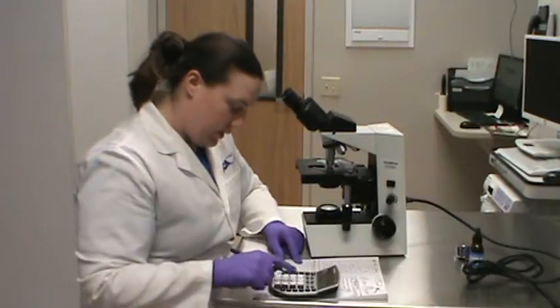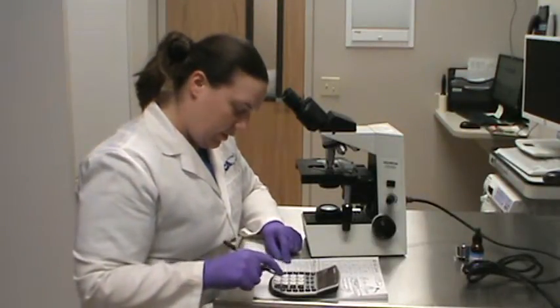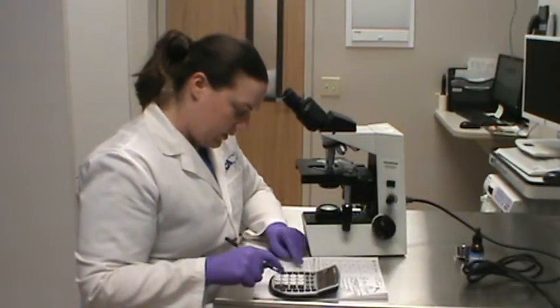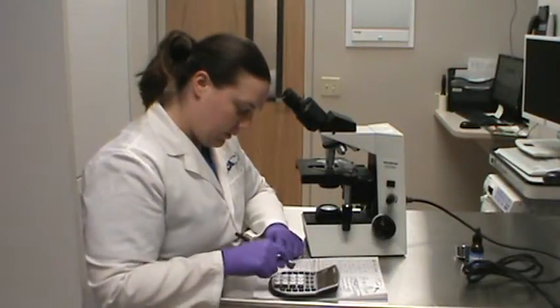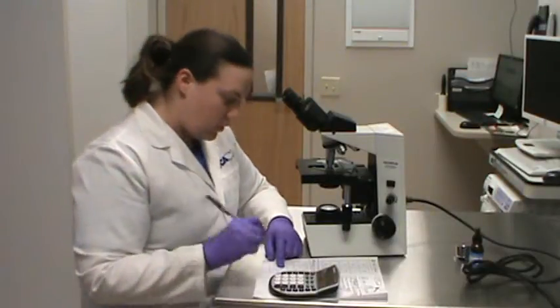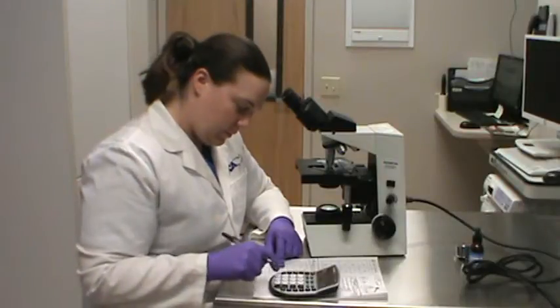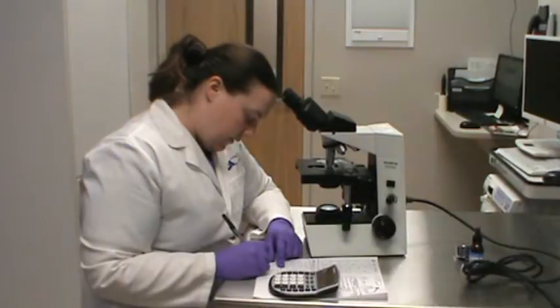Okay, so we have 6 plus 10 plus 5 plus 4 plus 3 plus 5 plus 2 plus 3 plus 4 plus 3 equals a total of 45 platelets that I noted in 10 fields. Then we divide that by 10, so that's 4.5.